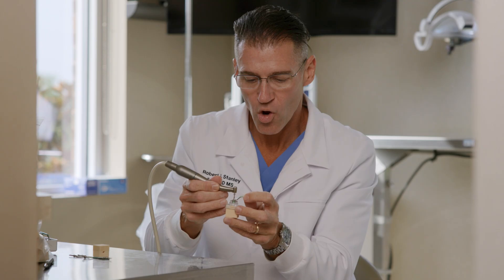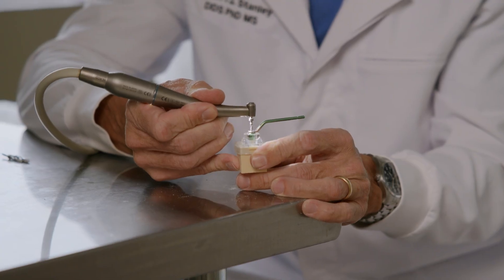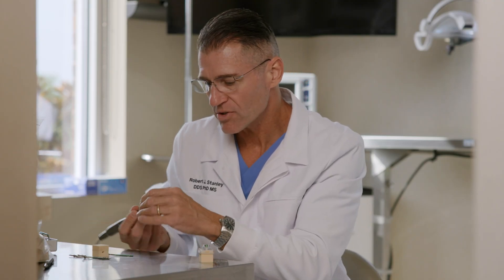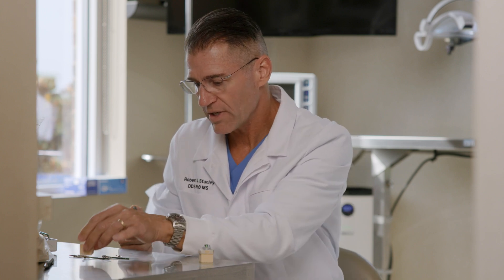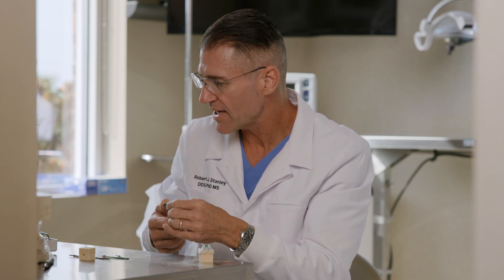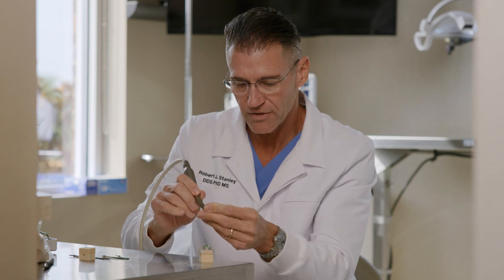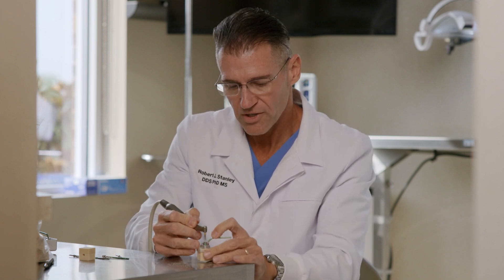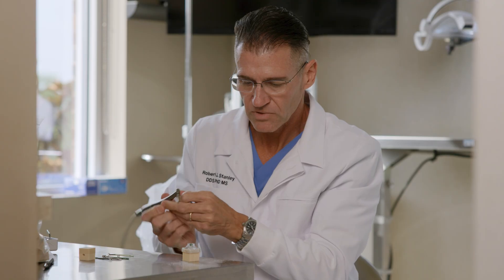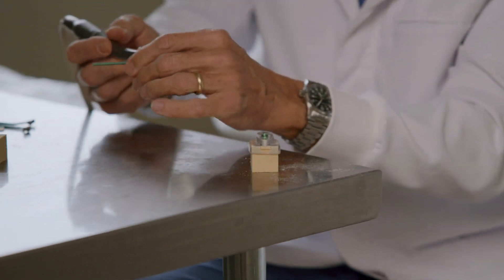I can't see what's happening inside, but I have to trust the guide is doing its job. For the second drill, all we're doing is changing the diameter, not the length. Notice how efficient we are — in and out with the drill. There's no sense in lingering inside the hole. The average drill time for any of these cases is about 1.2 seconds. It is extremely quick; there is no thinking involved. It's very mechanical. We place our third drill in position — done. And then the fourth and last drill in the sequence — done.